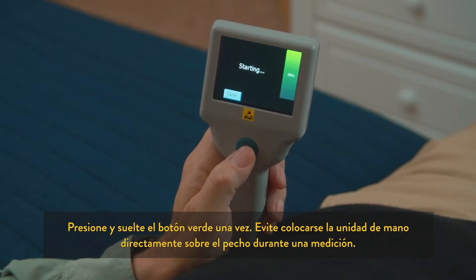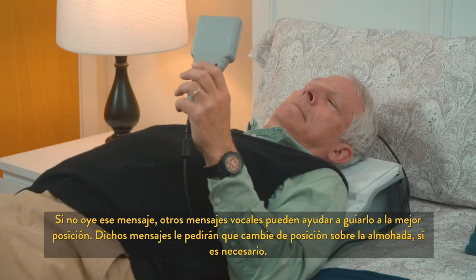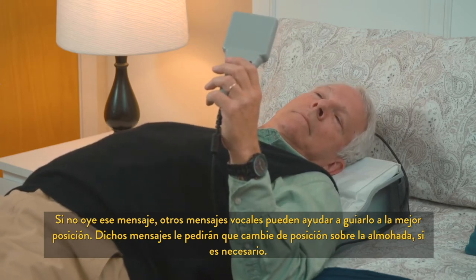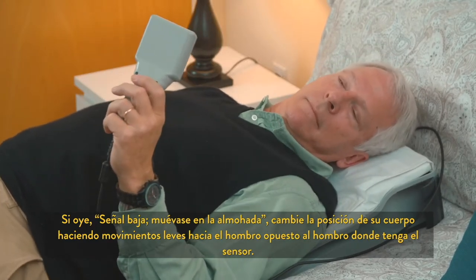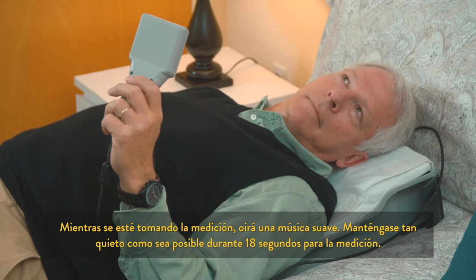Avoid placing the handheld unit directly on your chest during a reading. Adjust your position on the pillow until the bar on the screen turns green and you hear the correct position prompt. If you don't hear this message, other voice messages can help guide you to the best position. These messages will ask you to shift position on the pillow if necessary. If you hear a low signal prompt, change your body position by making slight movements towards the shoulder opposite of where your sensor is located. While the reading is being taken, you will hear some light music playing. Please be as still as possible during this 18-second reading period.